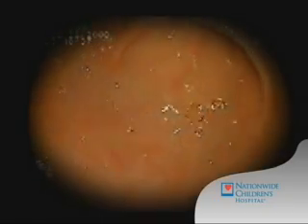The double balloon scope enters the intestinal tract through the stomach, which you can see here. This is the valve that separates the stomach from the small intestine.